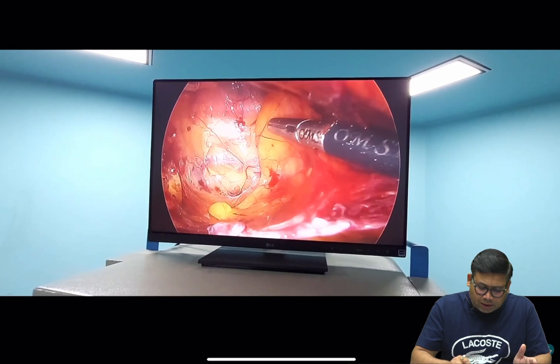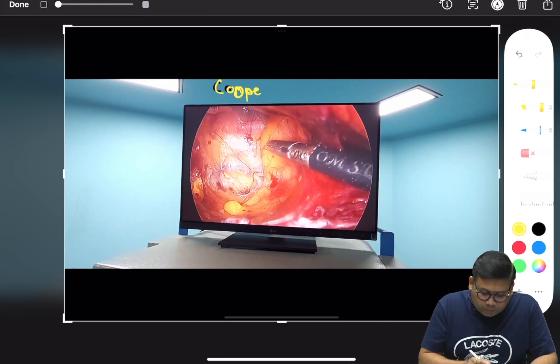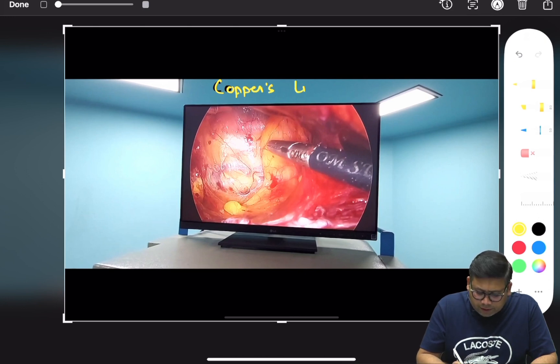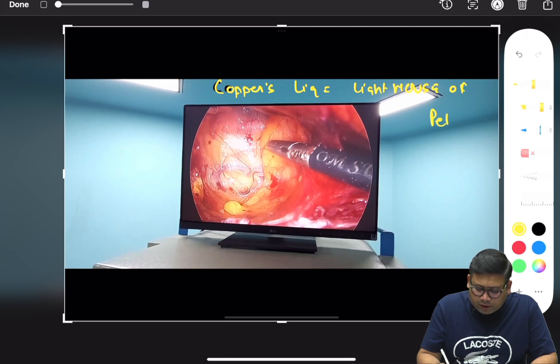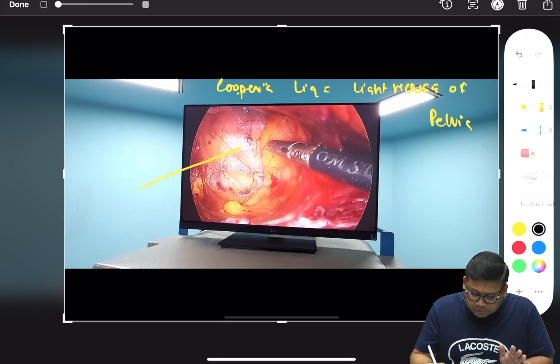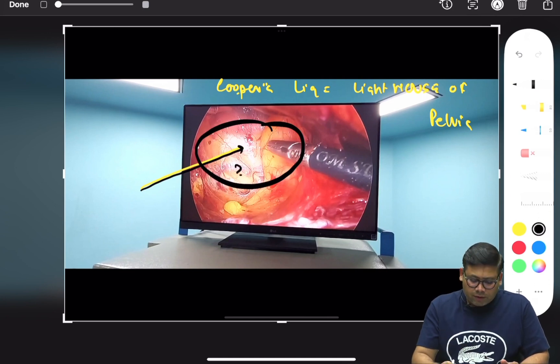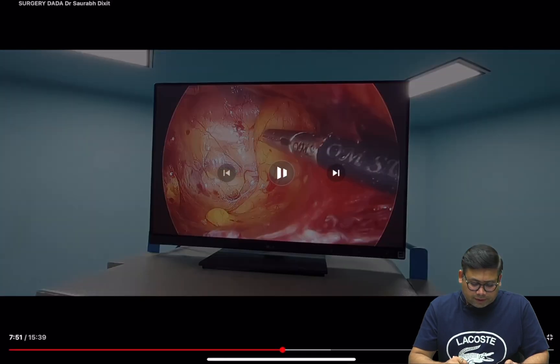Cooper's ligament is another name — what is it? It is known as the lighthouse of the pelvis. Understanding these basics helps you never forget the structures. Cooper's ligament is labeled here, and this is also the place where you may find the corona mortis.